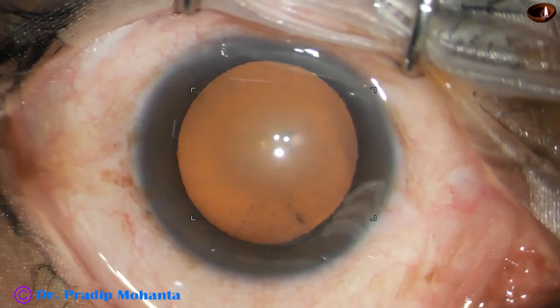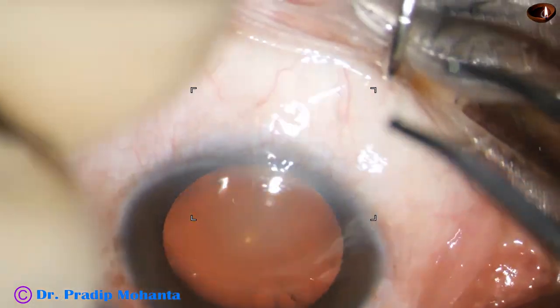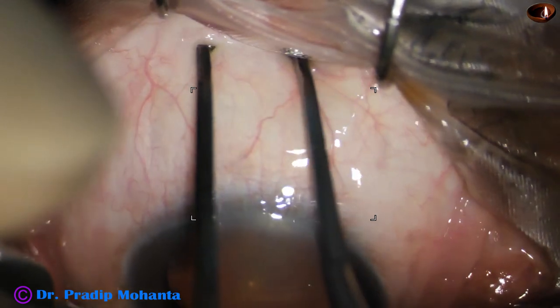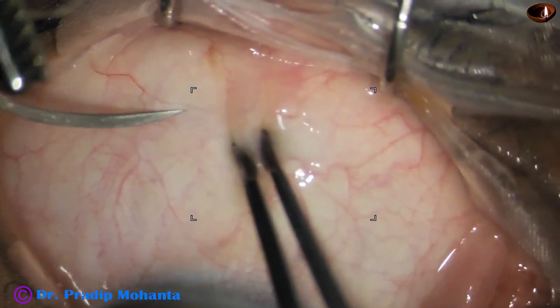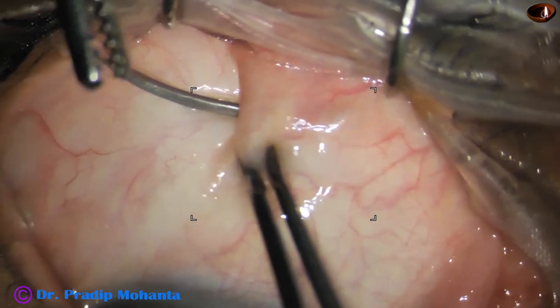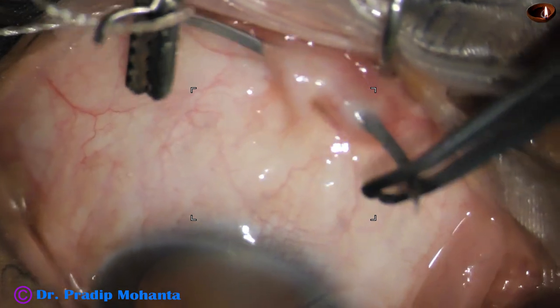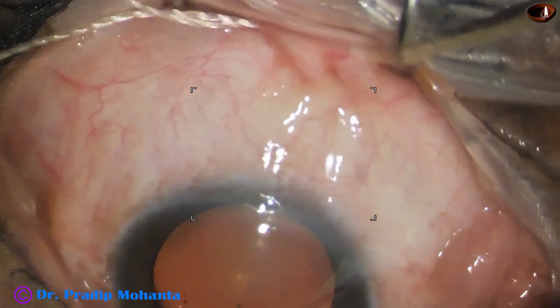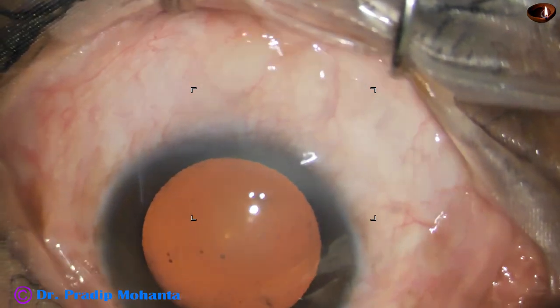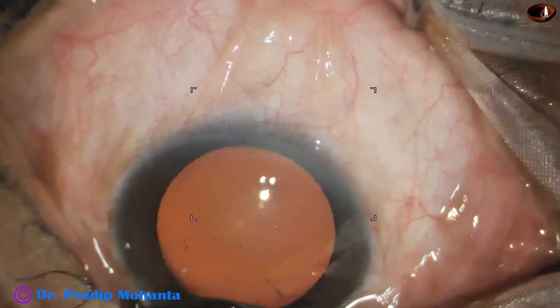It is important for beginners to bridle the superior rectus tendon. The eyeball is turned down using a muscle hook, and the superior rectus holding forceps is used. A thick nylon suture is passed under the superior rectus tendon. This is a very essential step that will give a very stable eye for making the tunnel, for the initial steps of the surgery, and it will help in nucleus delivery.